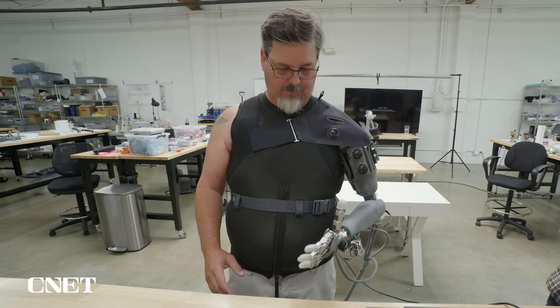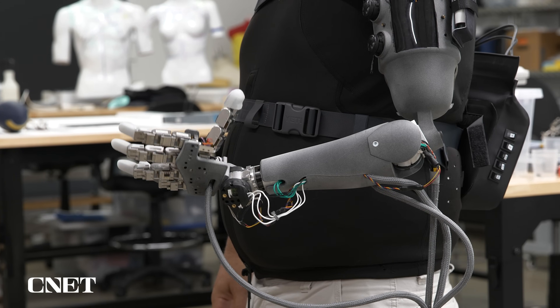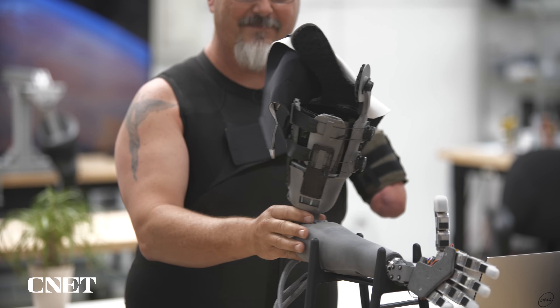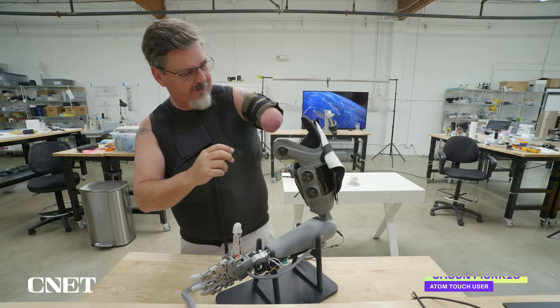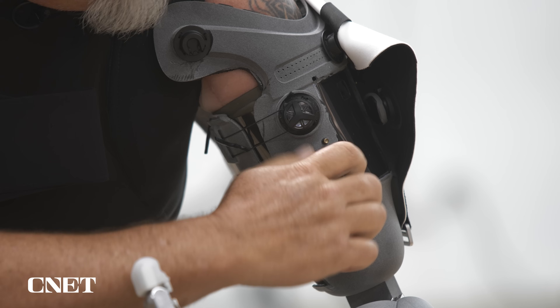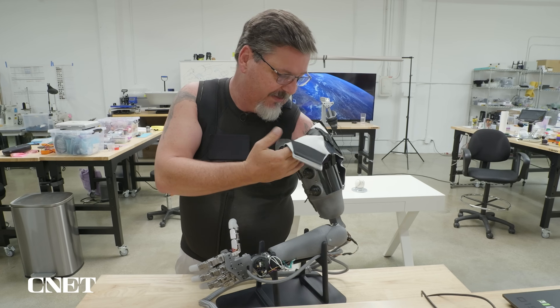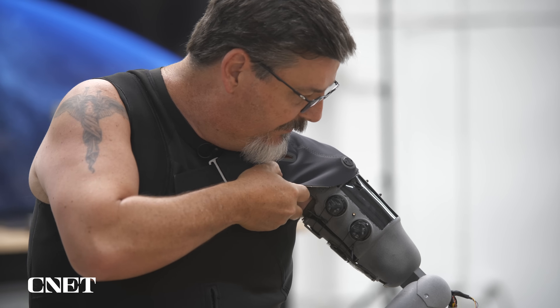This is Jason Morris. He lost his arm in a work accident 12 years ago. He's one of dozens of users helping test Atom Touch during development, and shows us what it's like to put on and wear the arm. Coming over the arm, I just loosen up the cuff on the inside and I can go straight down into the arm. These are just two boa straps I tighten up around the EMG cuffs. The last thing I need to do is attach the Velcro to the shirt itself.